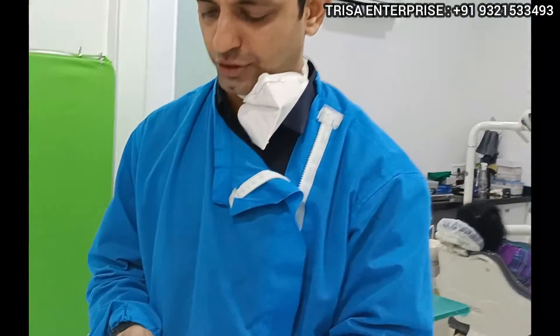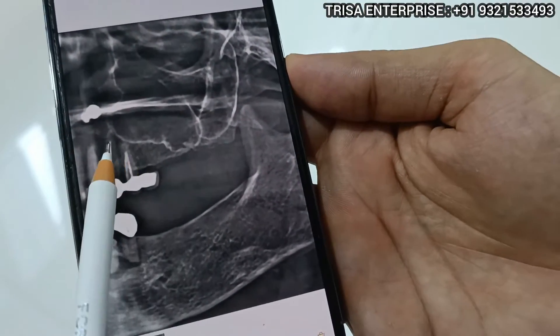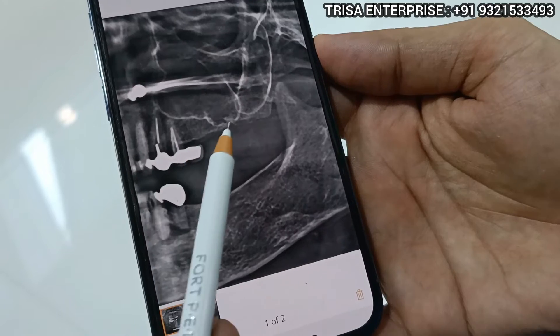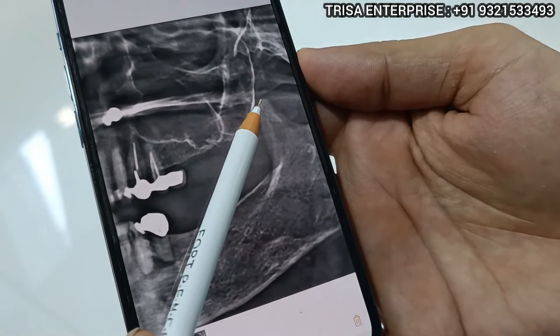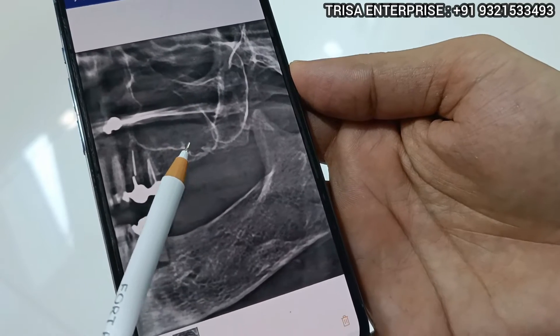The mandible is quite resolved. Let me show you the OPG — it will become more clear. As you can see on this OPG X-ray, these two teeth have fractured. We are going to remove the canine and premolar and place a pterygoid implant here.